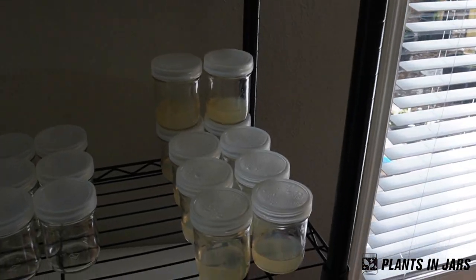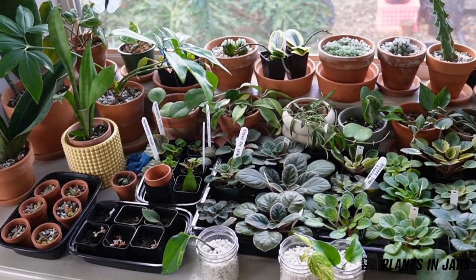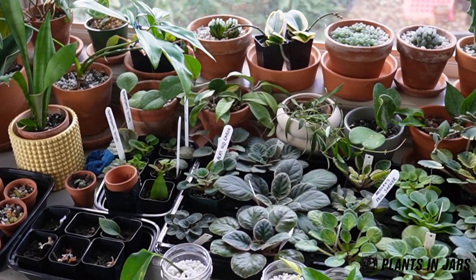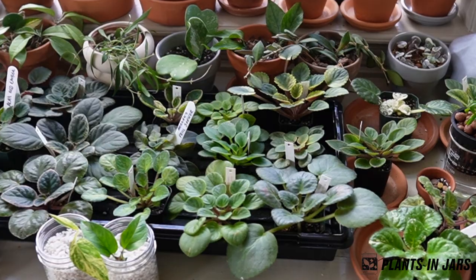I did make this tissue culture media yesterday. Ideally you wouldn't want to have tons of plants and organic material in the same room where you're doing tissue culture, but I don't have a separate room I can use solely for tissue culture, and I want to take advantage of this massive window, so I have a ton of plants in here.